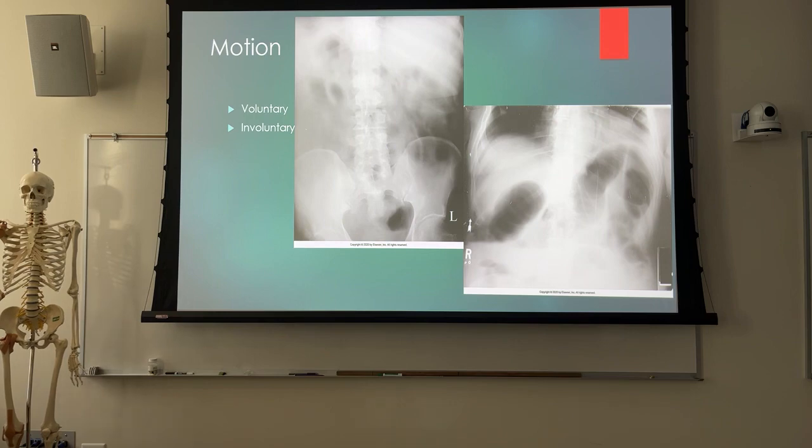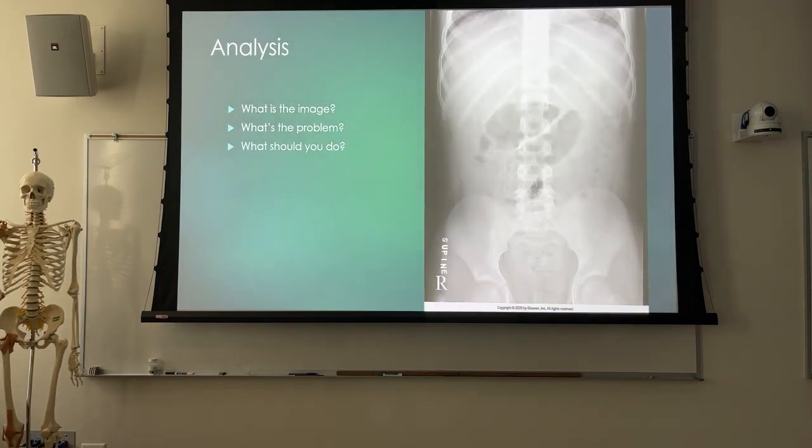If you have a patient who's got Parkinson's, anybody have a Parkinson's patient? They shake, they can't help it. You can have them hold on to the side of the bed, and that might help, or if they're upright, hold on to the wall bucky, and that might help. But there's a pretty good chance you're going to have motion on a Parkinson's patient.